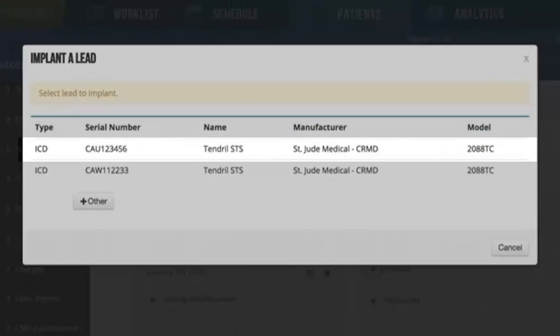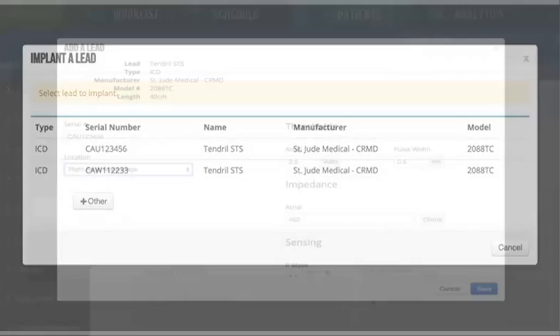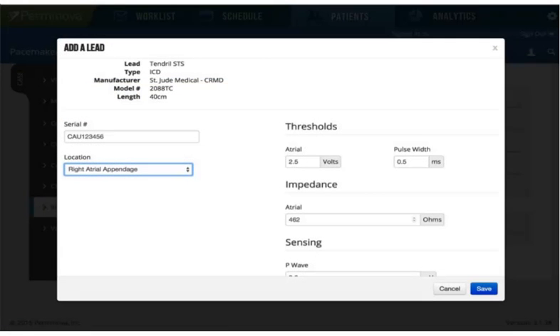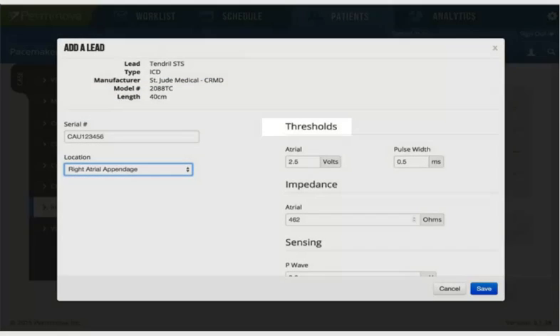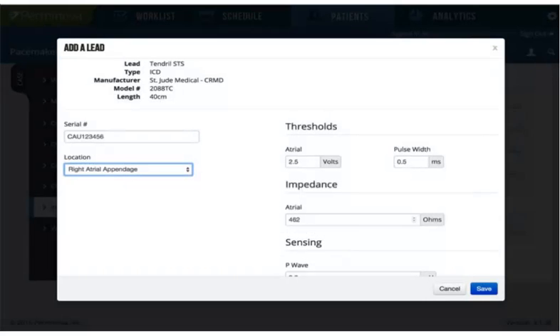For implant, click the row, then select it. Next, indicate the location of the lead and confirm the settings. Thresholds, impedance, and sensing values are taken from the file uploaded from the device programmer.